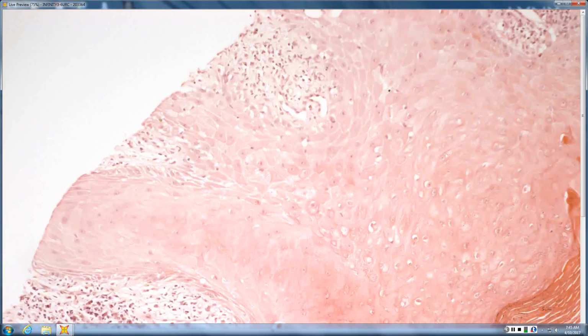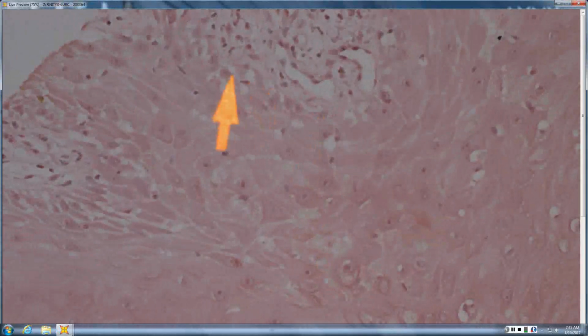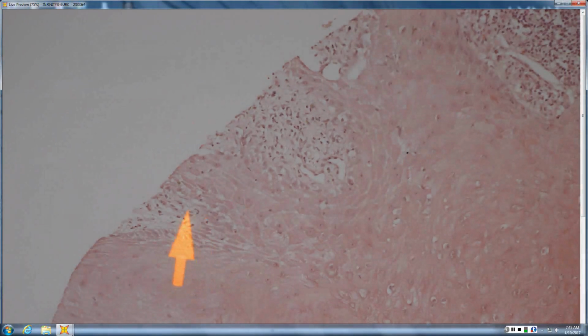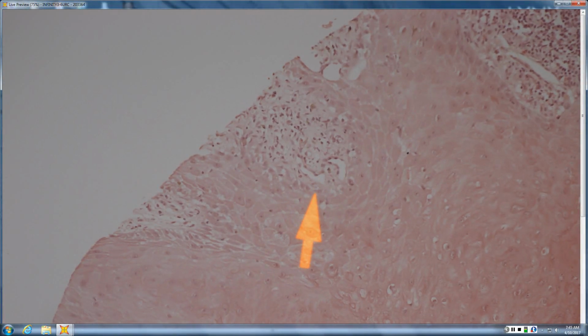Is the basal layer intact, or is it having a bad day? It's having a bad day. Sure. So do you see an intact basal layer shot full of holes, or is the basal layer gone and what you're seeing is squamous layers shot full of holes? I think it's more squamous layers. More squamous. So you have squamatization and PEH. Any thoughts?